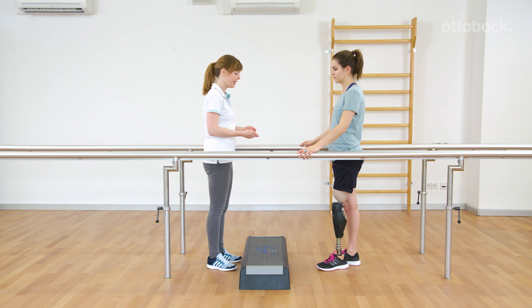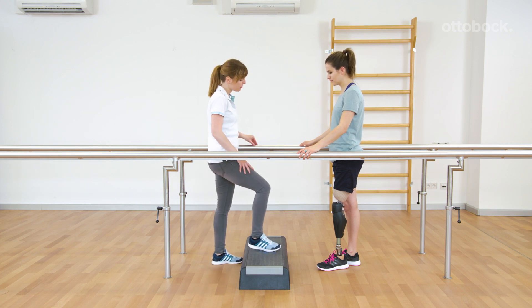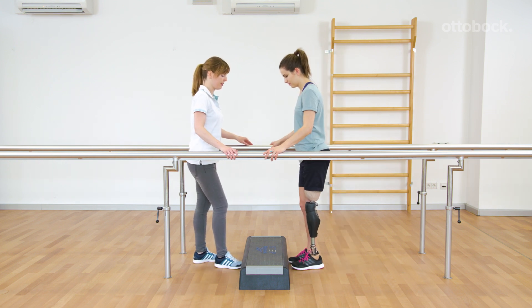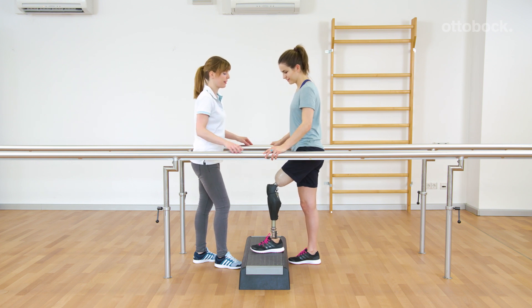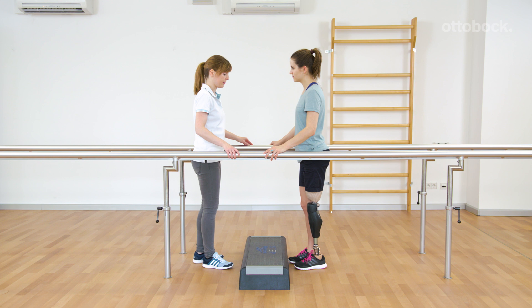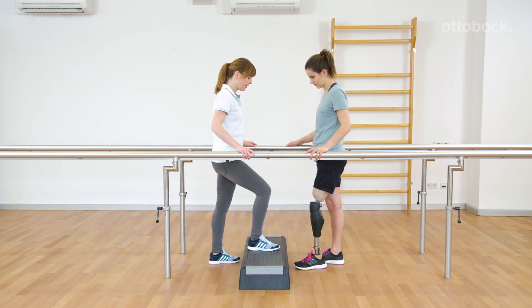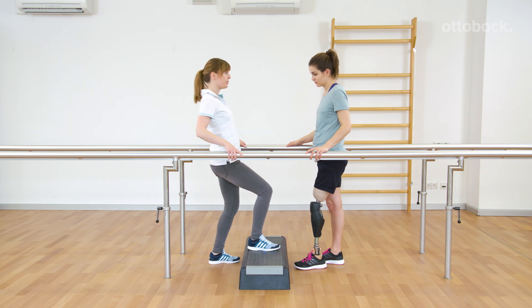Fransiska explains in which situations the stair function is aborted and the knee joint releases. After triggering the function, it happens if the prosthesis is unloaded or the foot is interrupted or repositioned. Additionally, the stair function is aborted with backward rotation of the lower leg.